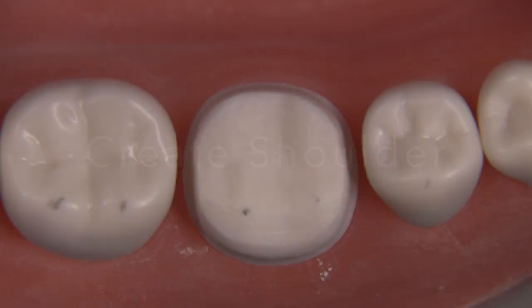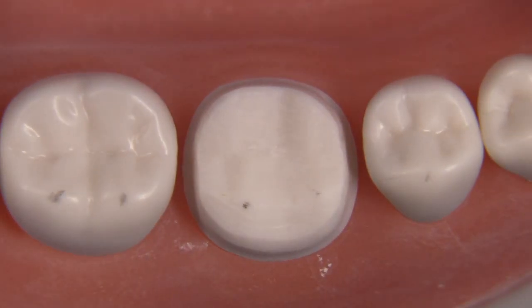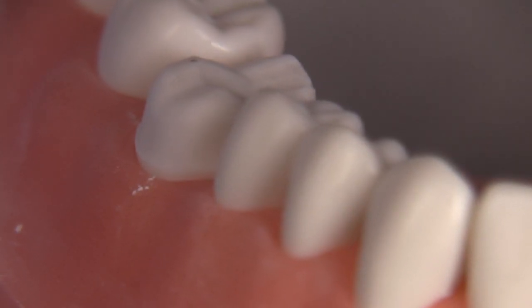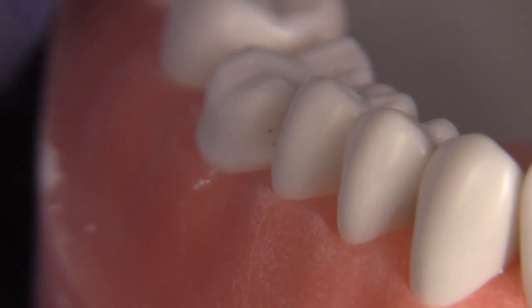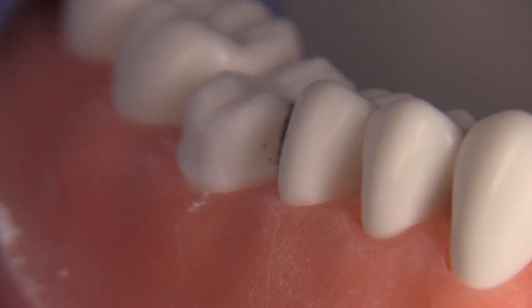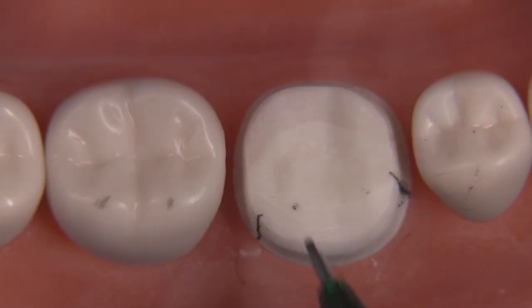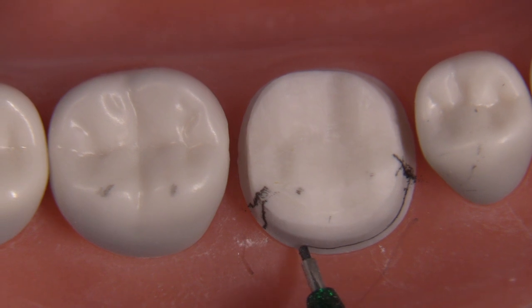So when doing a true modified chamfer you want it to decline like these here. Now let's create the shoulder — notice that we're doing the FGC kind of prep first and now we're converting this to a PFM by further reducing the facial, creating a shoulder, and removing a little bit more occlusally. The location of the shoulder on the mesial starts at the facial aspect of the interproximal contact. On the distal, the shoulder extension doesn't need to go that far interproximally because it's not an aesthetic area — going too far is just over-reduction. Make sure we're into the contact area so when the patient smiles we're not going to show any metal.